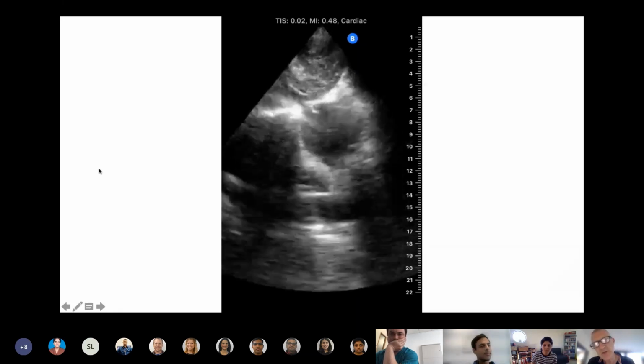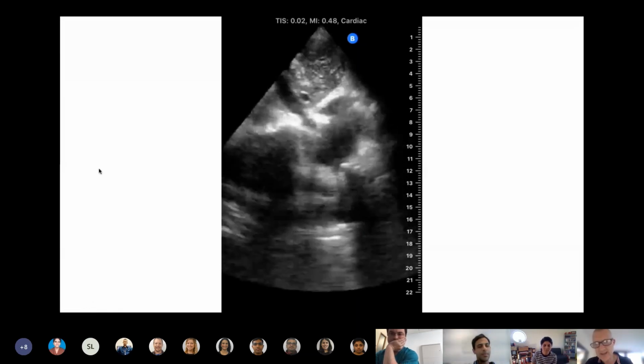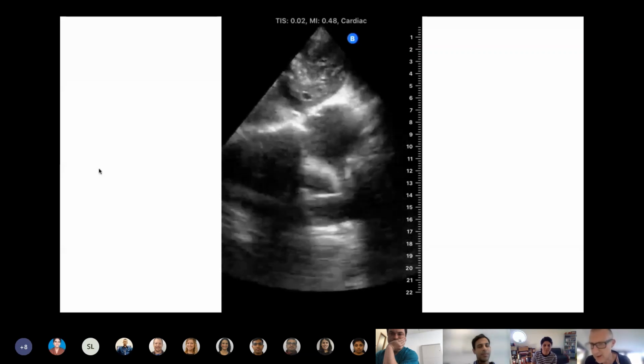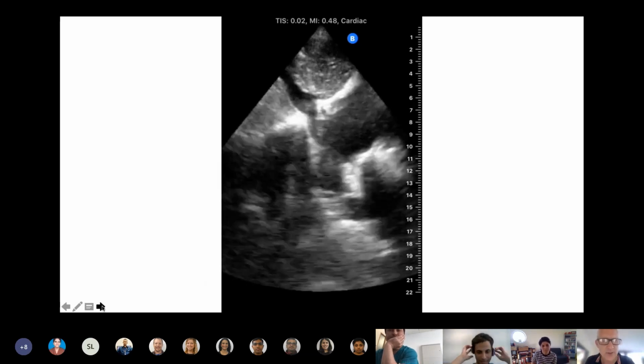So there we go. I find this is quite a helpful view, and you can pretty much reliably get it, as I'm finding in the care home setting, because all patients can lie flat by and large, and there's no problem really in acquiring this one. But trying to get nice, clean pictures with the body in the right position for the other cardiac views is more difficult.